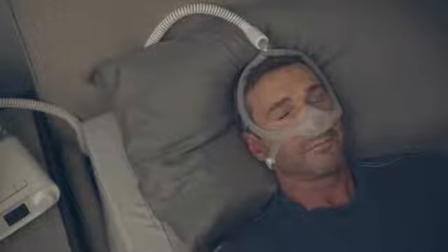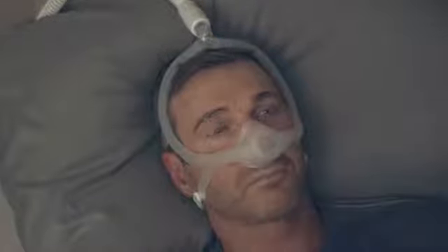It's normal to have some air leaking from your mask, but you don't want air leaking into your eyes or interfering with your ability to get a good night's rest.